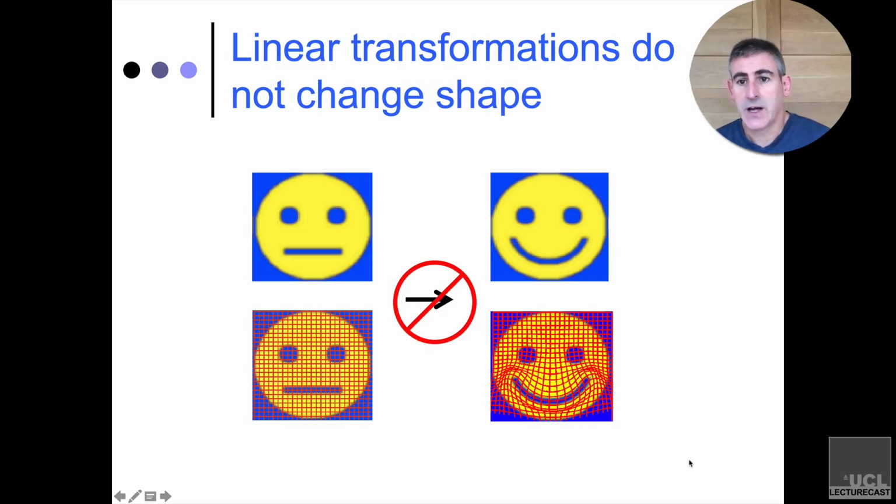The disadvantage to nonlinear transformations is that there's essentially an infinite way to calculate them, and if you have two images and 2 different nonlinear transformation packages, you're going to completely come up with different solutions, which means that you're not necessarily comparing like with like. On the other hand, a nonlinear transformation is far more powerful in terms of making the 2 images more similar to one another. There's no linear transformation that's going to make this sort of grim face into the happy face, whereas it's a very trivial thing to do for a nonlinear transformation.